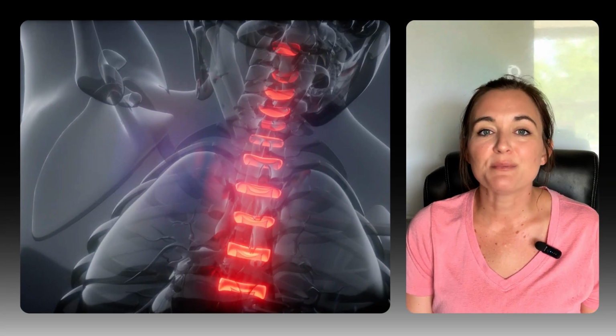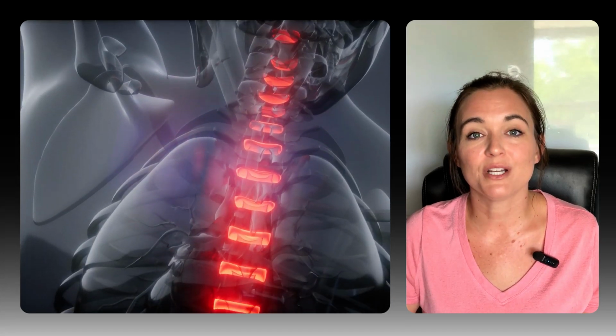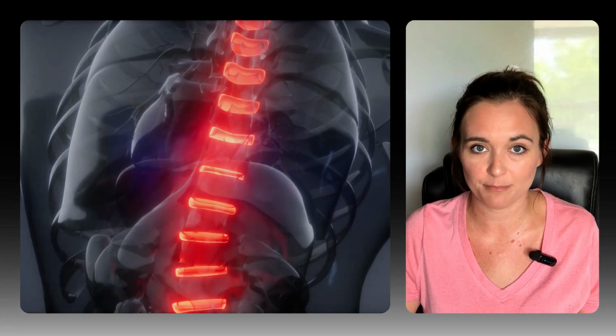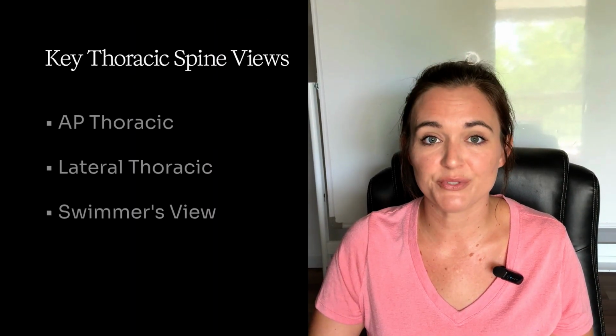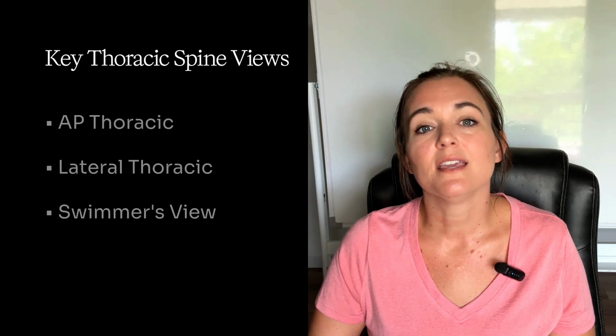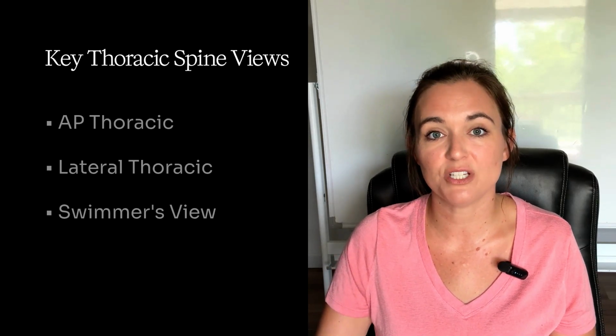All right, time to talk about the thoracic spine, your mid-back. This is your rib cage zone. It's the most rigid section of the spine, thanks to the ribs attaching to each vertebra. That rigidity makes it a little easier to image, but a little trickier when it comes to getting full coverage from top to bottom. We're going to cover 3 views here: the AP thoracic, the lateral thoracic, and the swimmer's view, which helps us see that tricky C7, T1 junction.